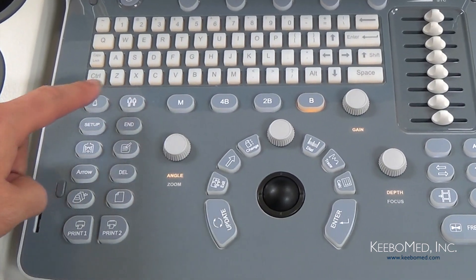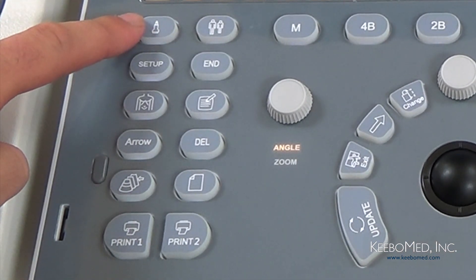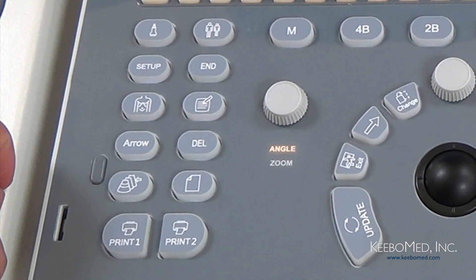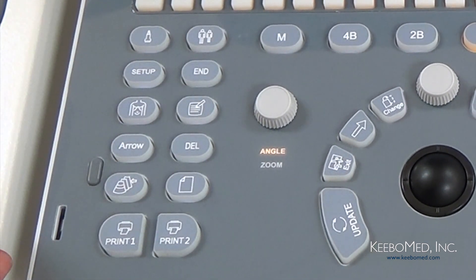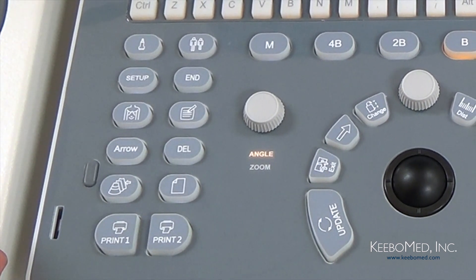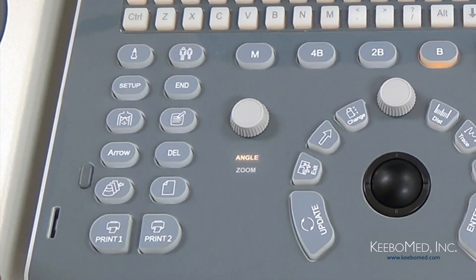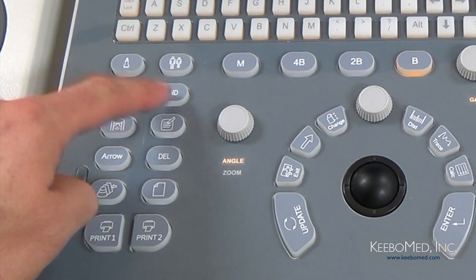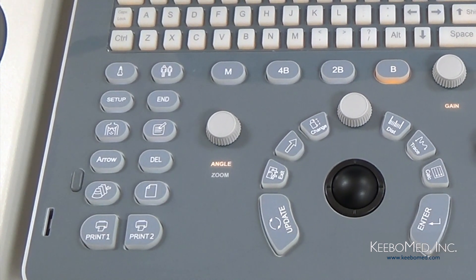Now let's look at the group of keys on the left side of the keyboard. First we have the Probe key, which allows you to switch between different probes and specific examinations for a selected probe. Next is the Patient key — pressing this allows you to set up new patient information such as name, gender, doctor, age, and other information. This is the Setup key, which allows access to and customizing of all the system settings. The End key is used when an exam is finished — it clears the screen for the start of a new exam.